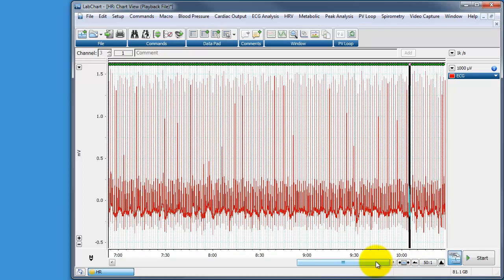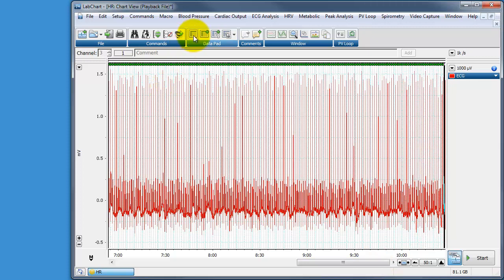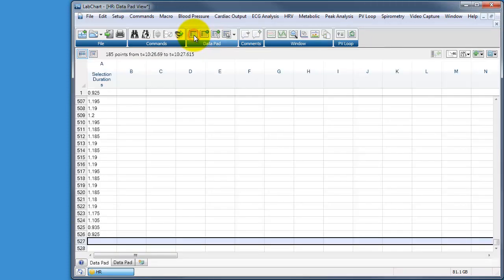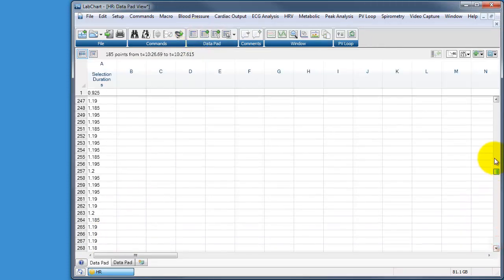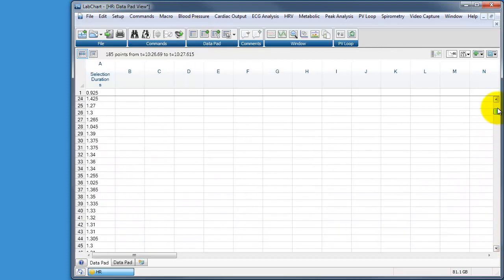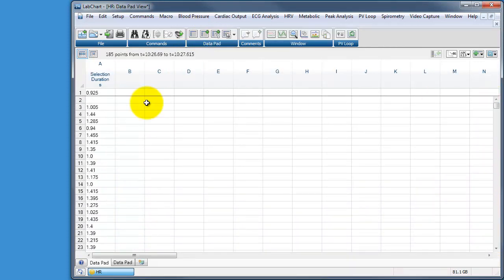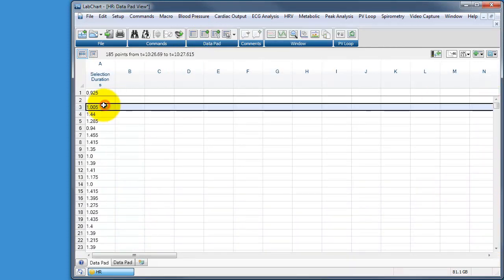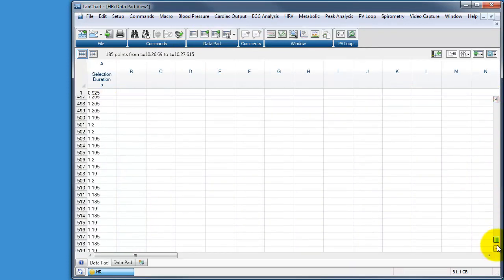So here we are almost at the end. So it's reached the end now. That's great. And here we go. Look at the data pad. And now we have 526 rr intervals calculated starting from the first rr interval and ending the last one.